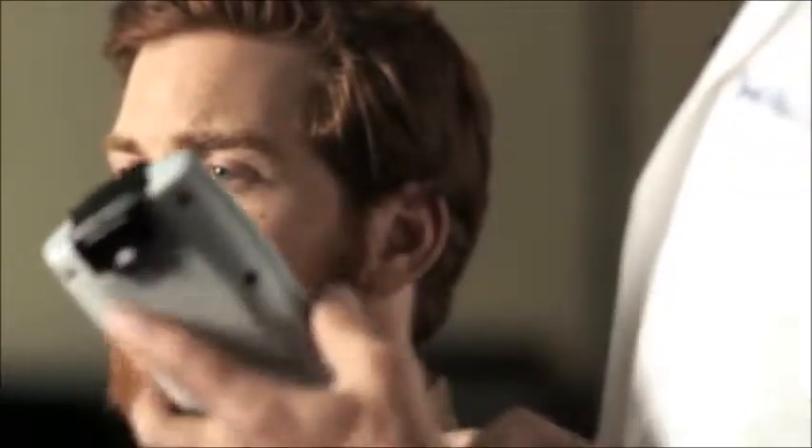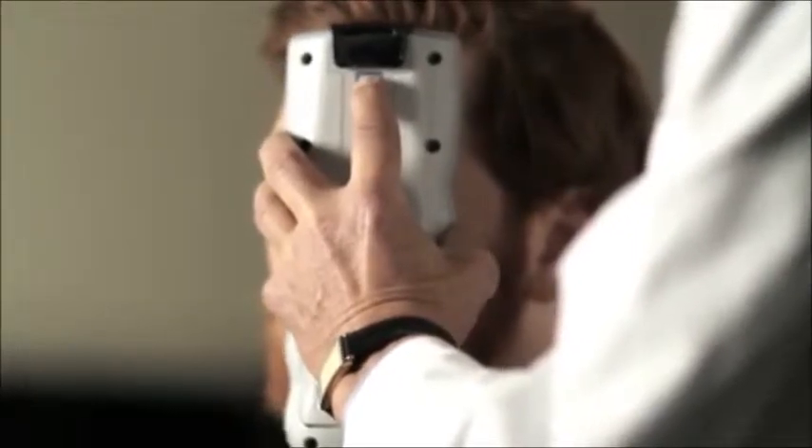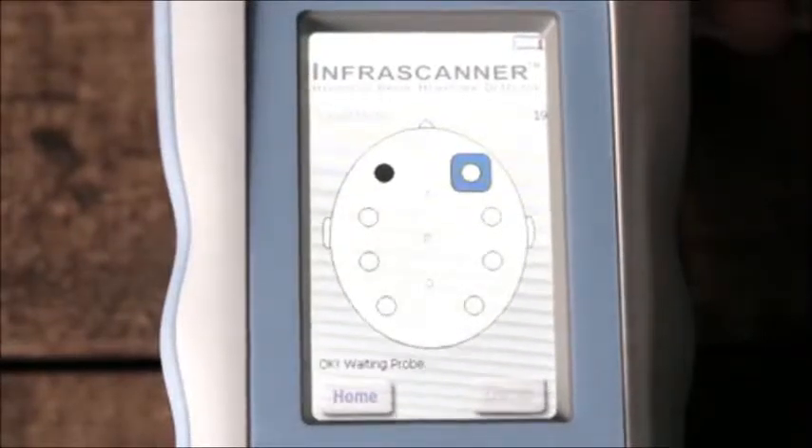We're now going to do an infra scanner examination and we begin by marking the left side of the head. We select a point in the mid-pupillary line between the hair and the eyebrow to avoid the frontal sinuses, which are about here. We place the fiber optic probe firmly but not too hard and click until we hear a signal. The blue square shows where a measurement is to be taken.